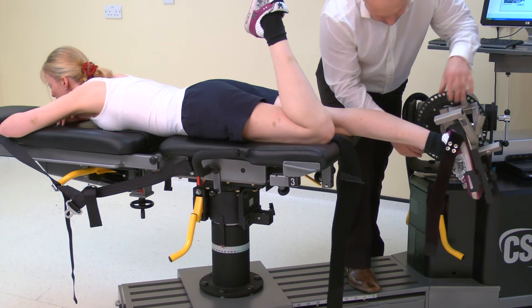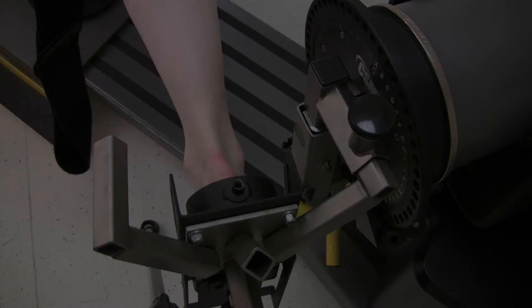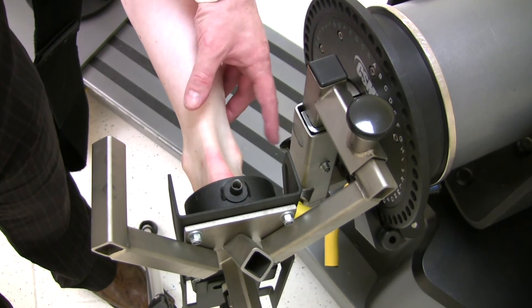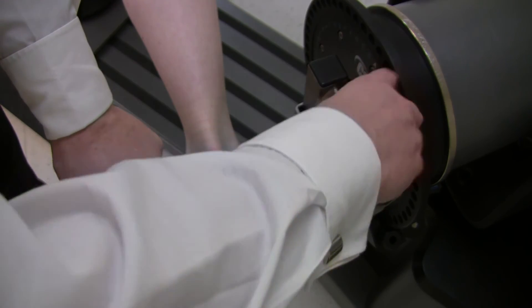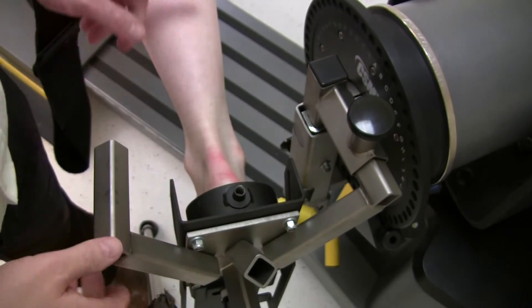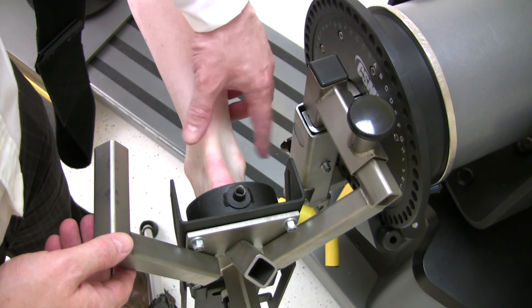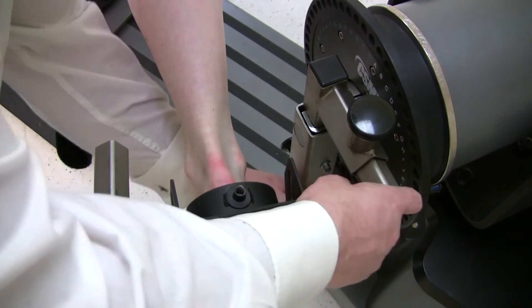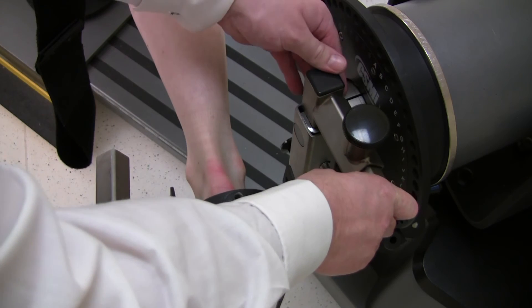Before fully securing the foot to the foot plate, adjust the axis of rotation. The axis of rotation for plantar and dorsiflexion is set once the lateral malleolus is opposite the black dot on the dynamometer input arm. Adjust for length by loosening the foot plate and extending or shortening the position. Note it may be easier to move the subject rather than the chair. Adjust for height by loosening the ankle adapter and extending or shortening the tube.